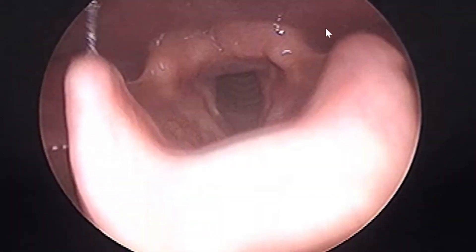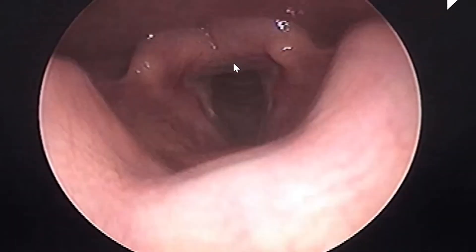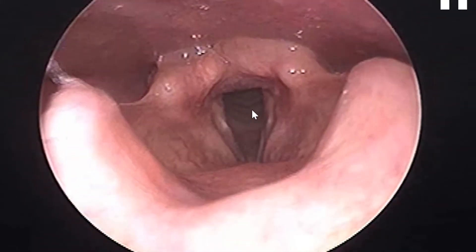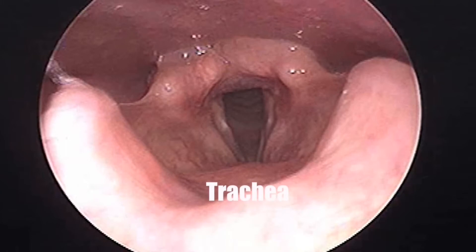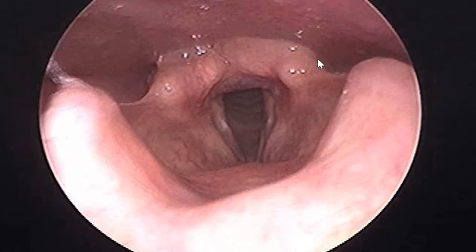Now you will see that once the vocal cords open fully, the pyriform sinuses — the food inlet — close. You can see through the open vocal cords into the trachea, which is the windpipe. The trachea is always open, lined by C-shaped cartilage, as you can appreciate. These are the cuneiform cartilages, the aryepiglottic folds, and the pyriform sinuses, which are now kind of closed.